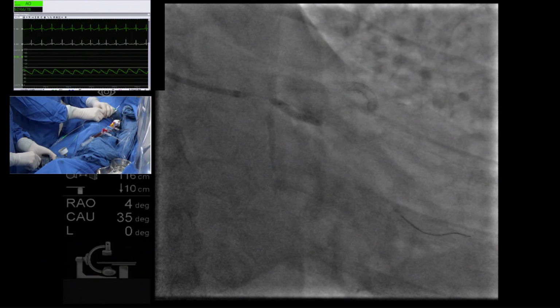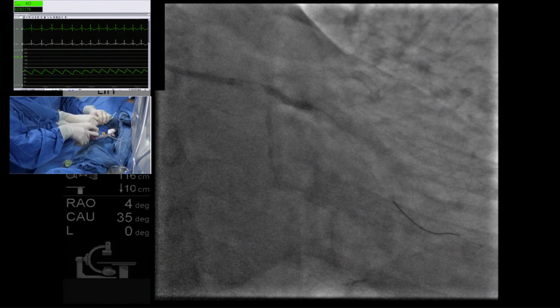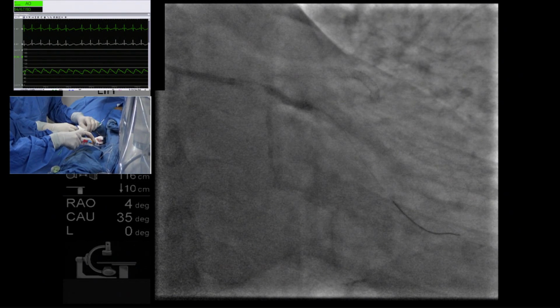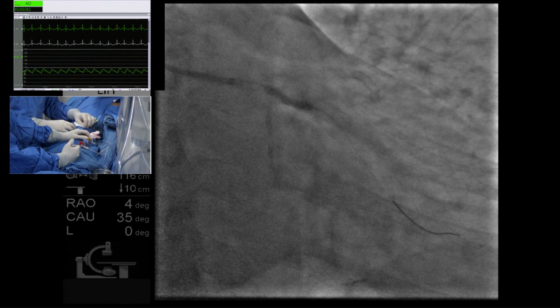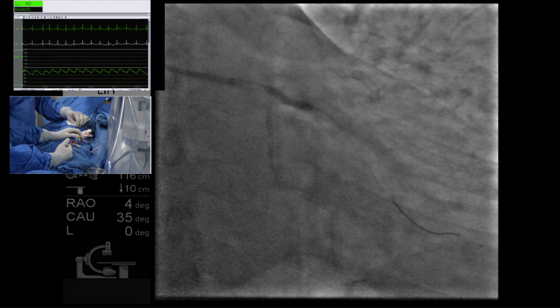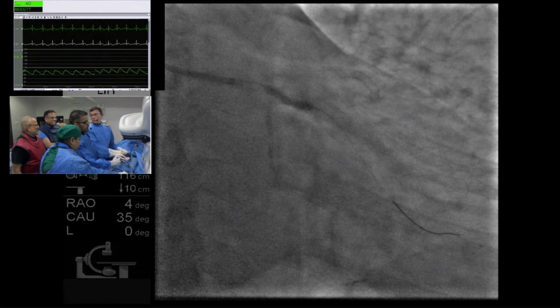So this is, we probably need like a 34 millimeter. The exact size, and normal is 31, but we can take 34. If you are taking Onyx, which size do you want? Because Onyx will grow. A 3.0 probably. I think it's the same. You don't think so? I think I would go one less. What is here? 2.7. You have 2.75.